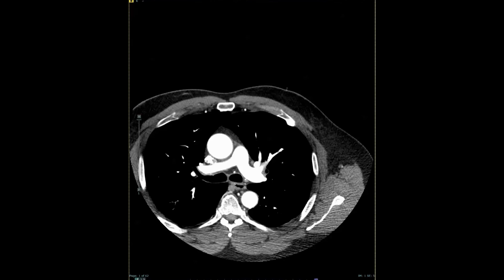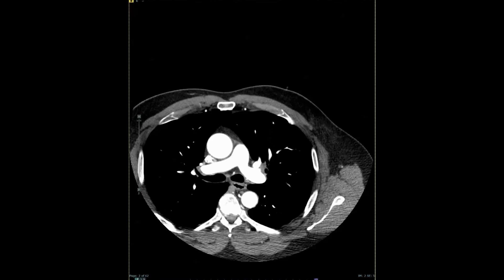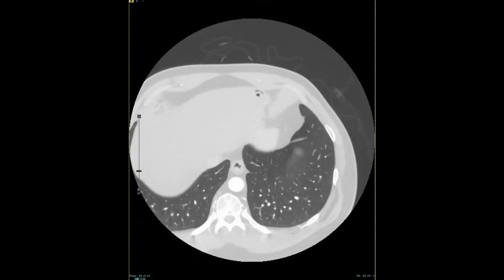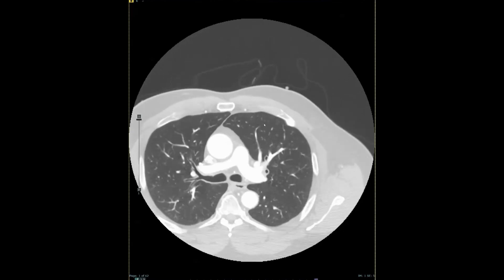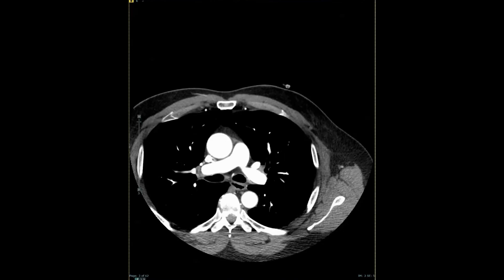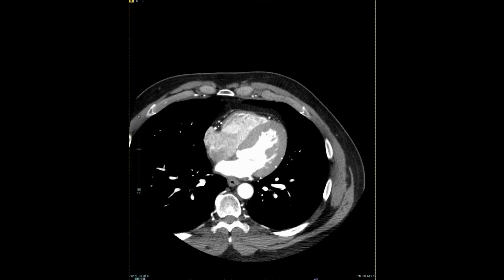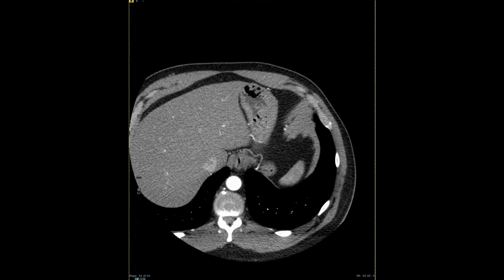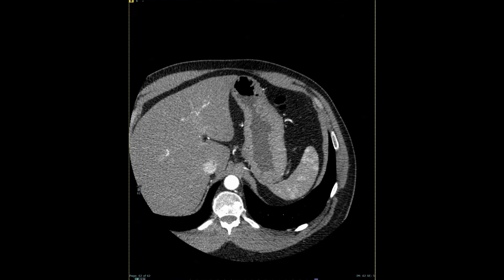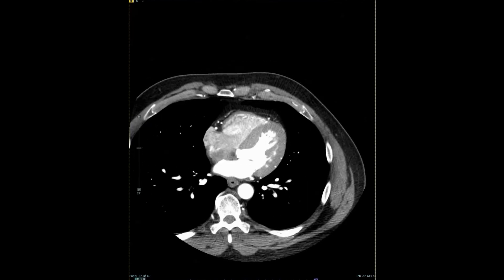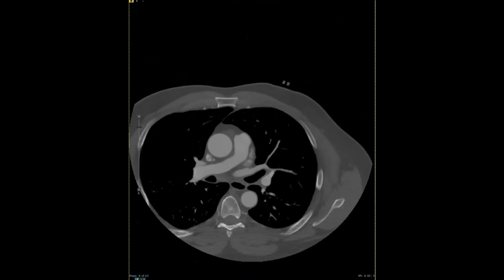After thoroughly evaluating the heart and the coronary arteries, we lastly look at the rest of the structures of the chest. By changing the window, we can see the lungs very clearly in black, and we can look for things like pneumonia or early lung cancers. We can also assess the area around the heart, or what we call the mediastinum, and look for things like enlarged lymph nodes. We can look into the belly and look for things around the liver, the spleen, and the stomach. And lastly, we can look at the bones and assess for things like fractures.